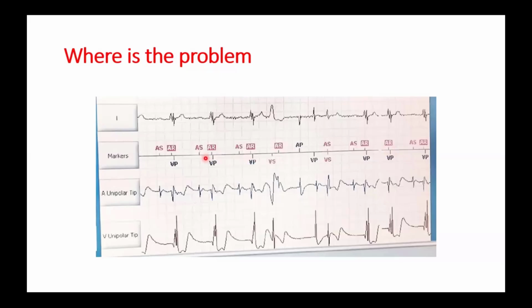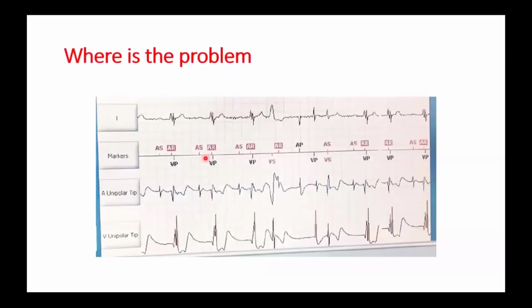Yeah. This was actually a patient who needed to reposition both leads.